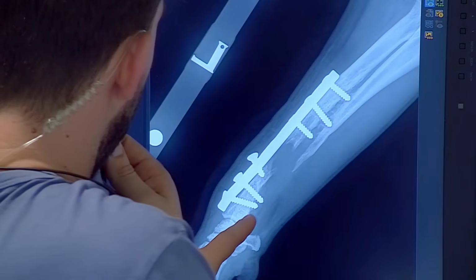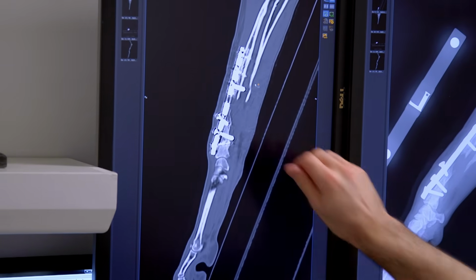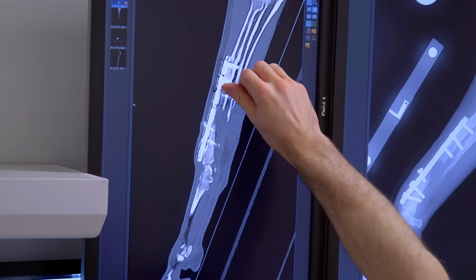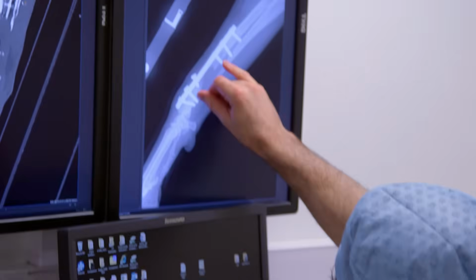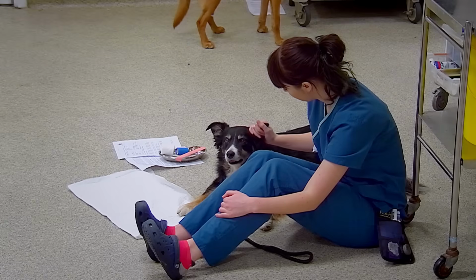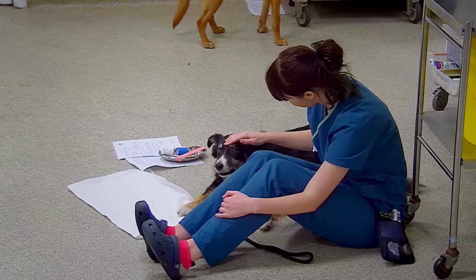Come on in, come on in. So I've got all the information I need up here on the screen. So that bone is probably dead to there. And that top bone is probably dead up as far as there. So to get living bone, I have to saw there and there, okay? Creating a new bespoke implant will take several weeks, and there's no guarantee of success.